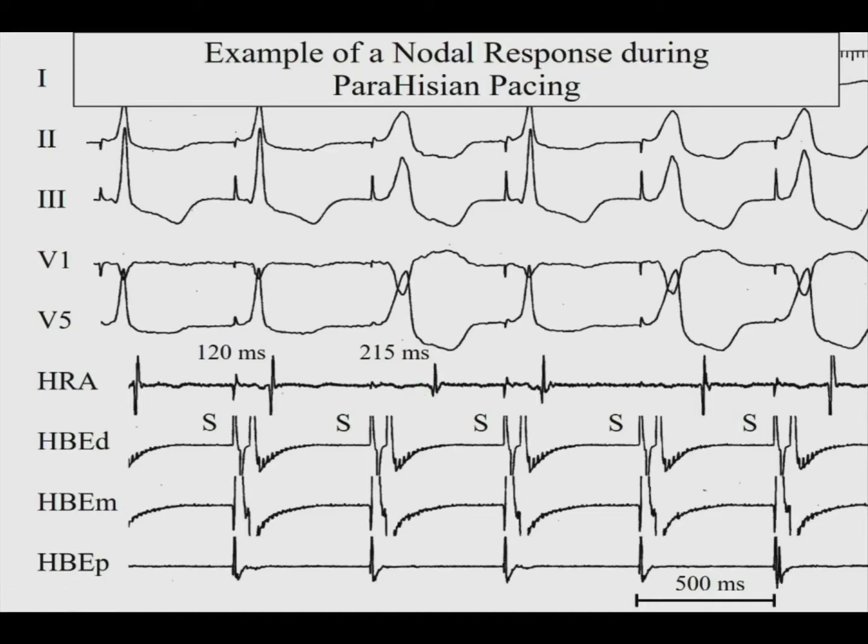So this is a maneuver that will come in handy in certain situations in the EP lab. But like all these maneuvers, the more you practice, the better off you'll be. So I would encourage you, even with AV nodal reentry, you got a catheter at the His, just start pacing at high outputs and look at these responses. So try to go through all these maneuvers in every case just so you'll be comfortable performing them.